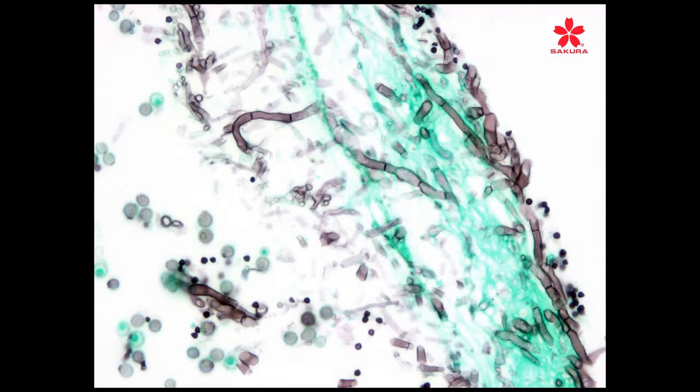So now another thing to see here is you see a variability in the nature of the stain, in the intensity of the stain. And that's one key thing, because these organisms will not all pick up silver at the same rate. They will primarily at the same rate, but this is why this stain has to be monitored, because you see here very distinct septi separating the organisms. You see the darker gray appearance here, very distinct, but you see a lighter gray appearance here, darker here.